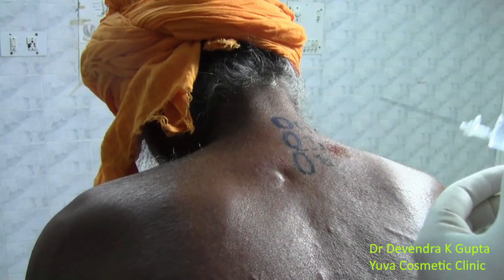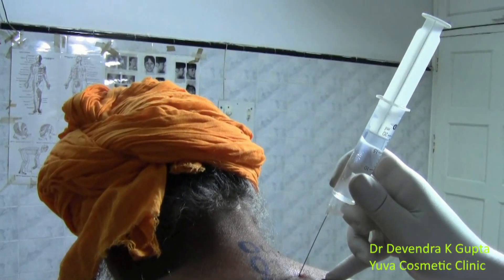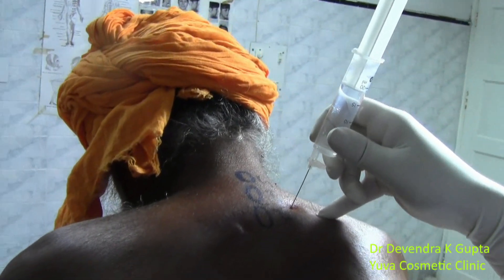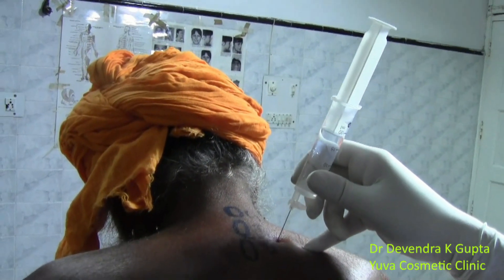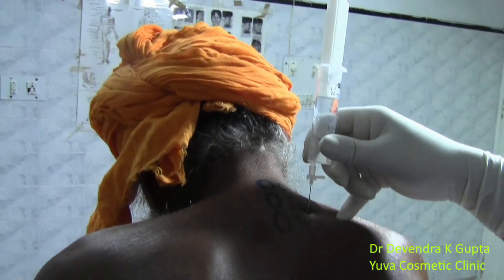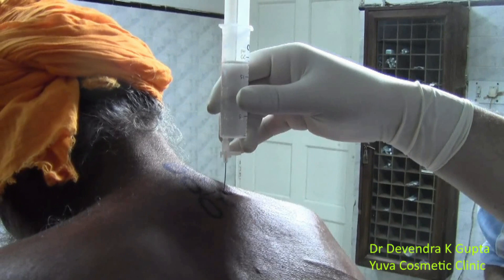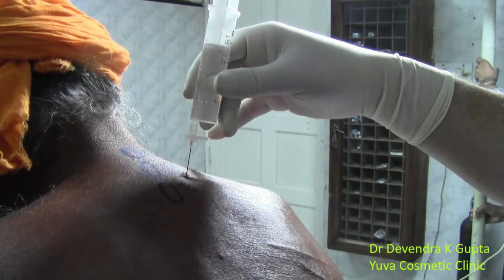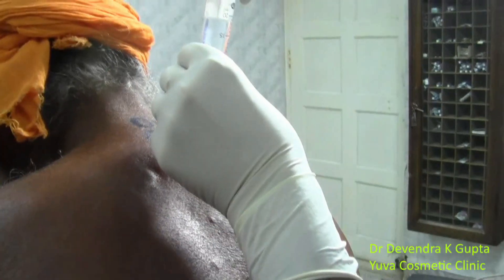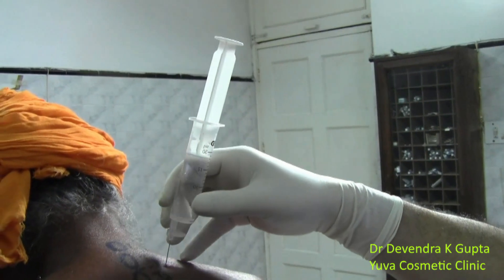Insert the needle perpendicularly and see whether it strikes the bone or not. Insert the needle little caudally. The needle strikes at this distance — about 3.5 cm — so inject a little amount of the solution. Now the needle has struck the transverse process.